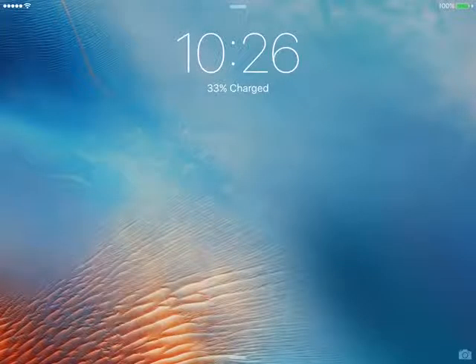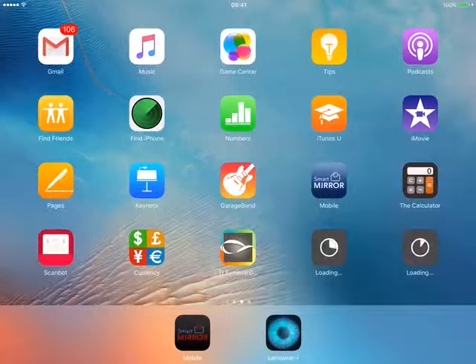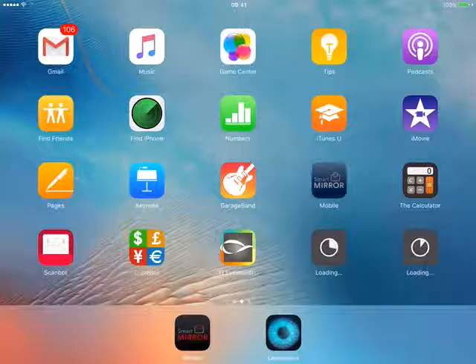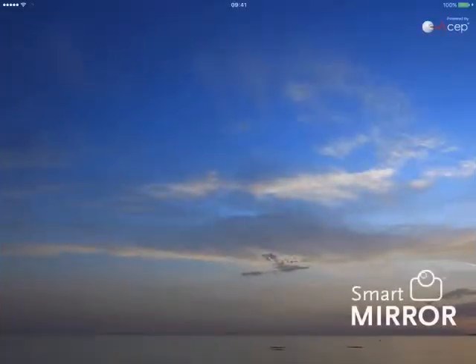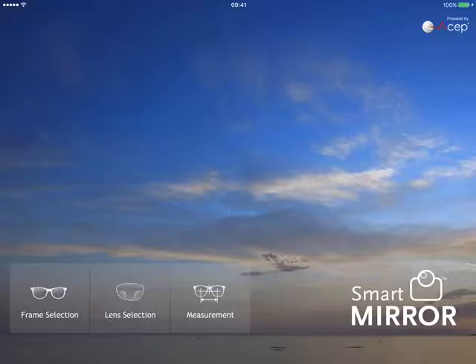Mark McGraw version 2. Similar to version 1, we have 3 modules: frame selector, lens simulation, and measurement.